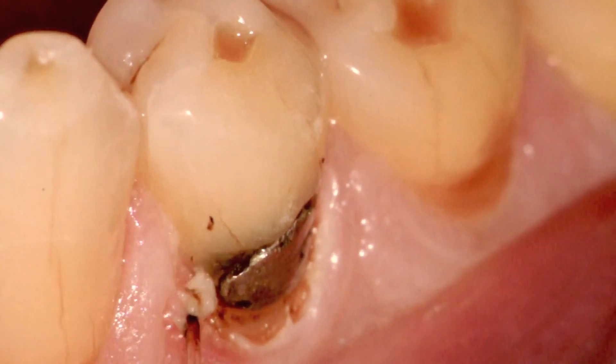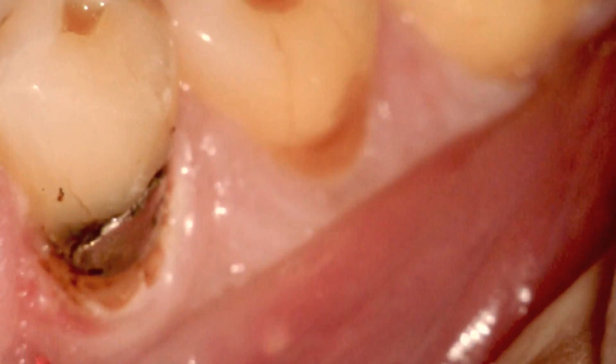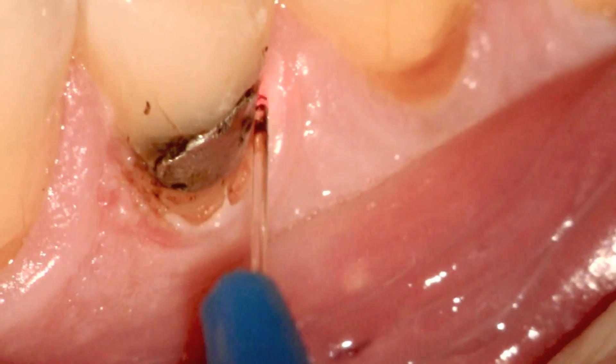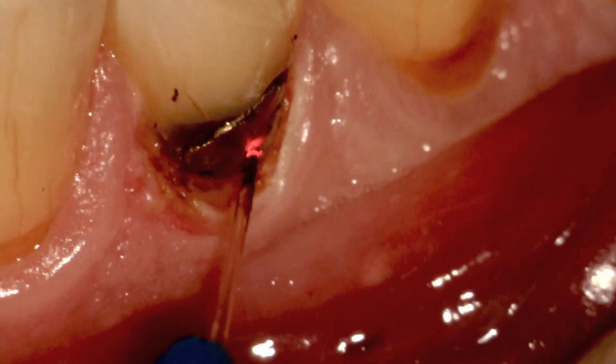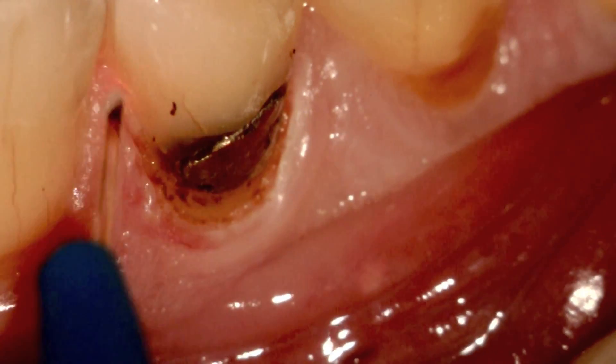You can see we're able to remove the tissue. We're not getting a lot of charring — we're looking at the laser-tissue interaction. Just to show that you don't have any worries if you do accidentally touch the amalgam: here I'm actually working around, just touching it lightly. You'll see that there's no interaction at all — no arcing, no sparking like you would have with an Electrosurge.